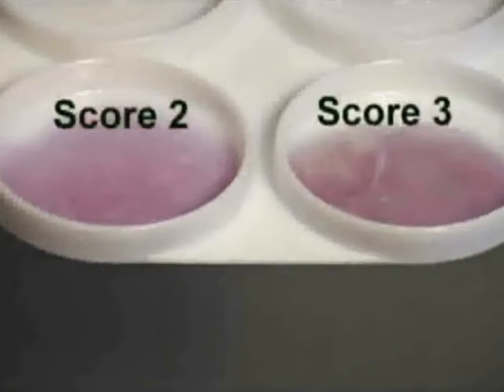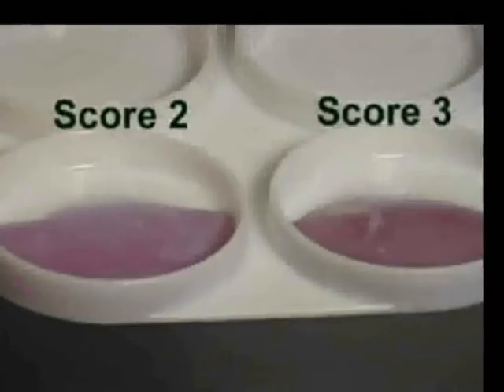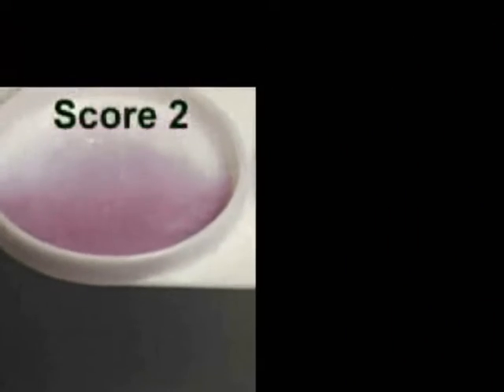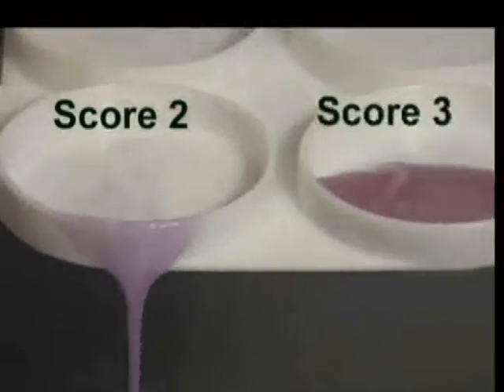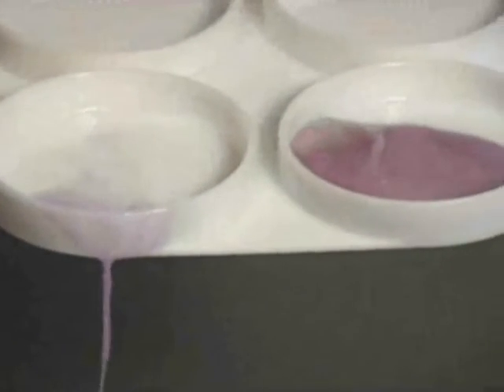When you pour out the score two mixture, a gelatinous mass falls out and may leave some liquid in the cup. When you pour out the score three mixture, a gelatinous mass also falls out, but without leaving any liquid behind.